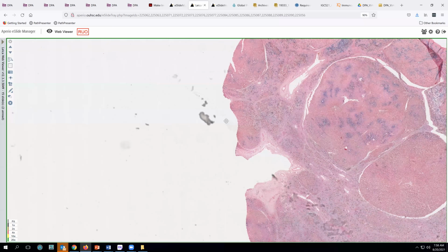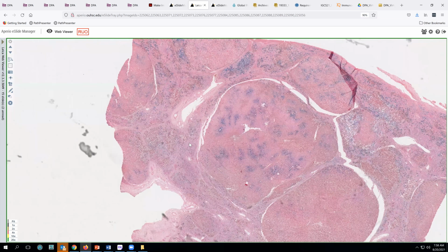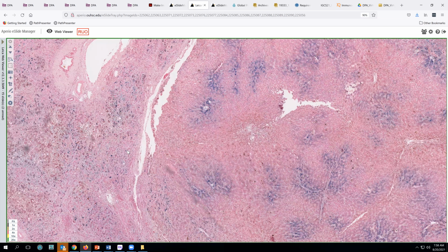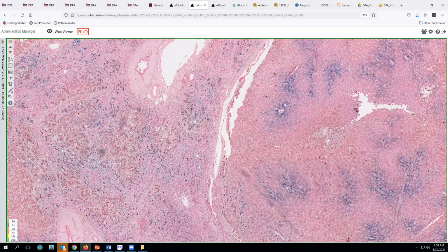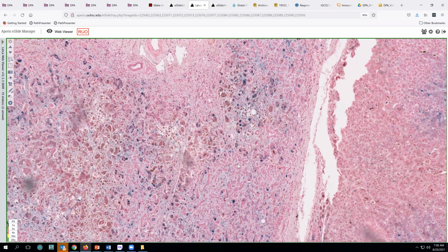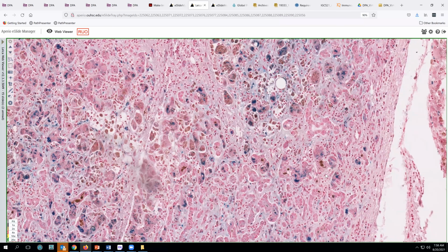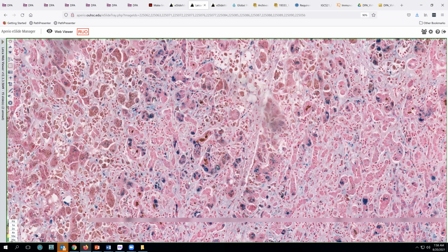As you see, there's a lot of blue pigment in this liver. This is much more than should be seen normally. This was a 4 or 5 plus amount of iron. And as we see, now you can see in contrast, bile, iron, iron, iron. So this is very helpful to recognize that we have a lot of iron here.